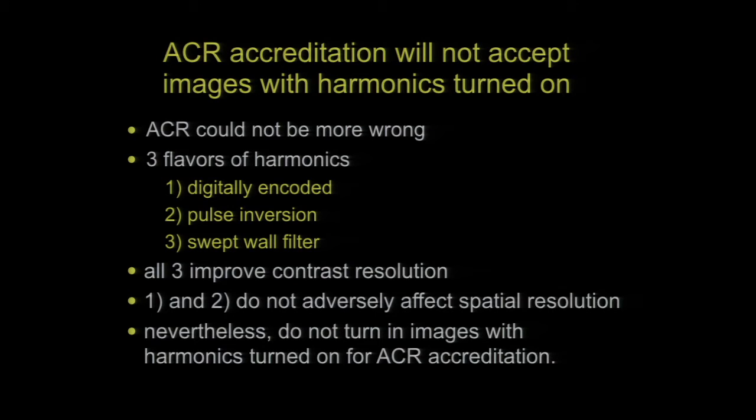Now, the ACR will not accept images with harmonics turned on. The ACR, again, couldn't be more wrong. There are 3 flavors of harmonics. There's digitally encoded, pulse inversion, and swept wall filter. The swept wall filter indeed does destroy axial resolution, but these other 2 maintain or even improve spatial resolution. So if you know what kind of harmonics you have, it actually improves your resolution. So the ACR is absolutely categorically imperatively wrong.